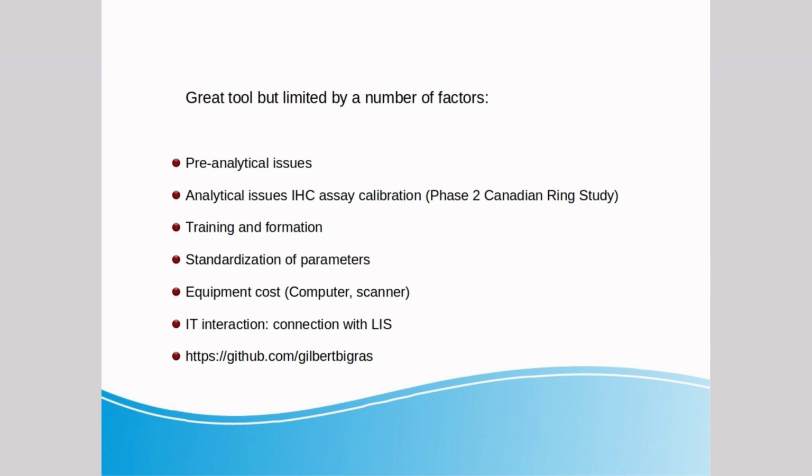We also deal with equipment costs. Computer and scanner are relatively expensive. One big final problem is IT interaction. It's not that easy to connect a new type of instrument with the current LIS. This is quite a challenge.